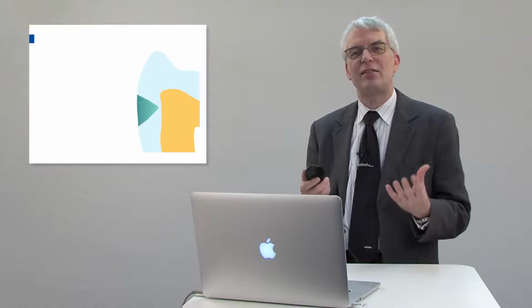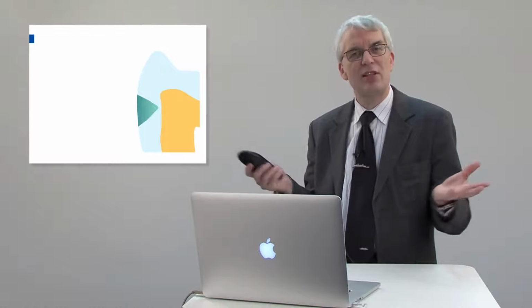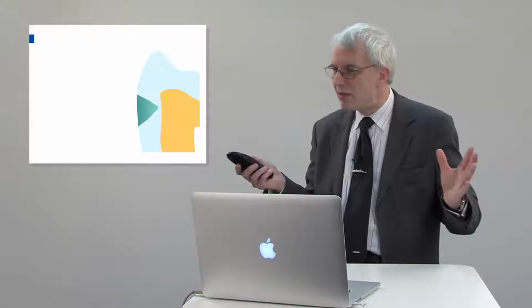So in a first step, what we need to do is etch it away. And once we etch it away, we have access to the lesion. And now we can have a very low viscous resin infiltrate into that lesion and seal it, reinforce it, and stop the caries process. This is the basic idea of Icon. Very simple. And now, let's look at the basic steps.